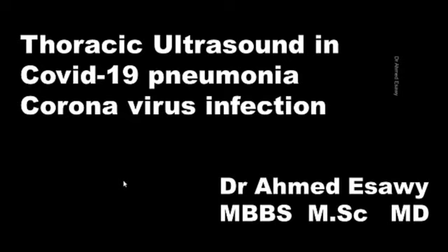It is easy to do ultrasound in the ICU, using portable ultrasound in patients who cannot go to CT units. Thoracic ultrasound will be, or must be, a basic examination for the new generation of internists, new generations of doctors in ICU, and new generations of doctors in radiology.